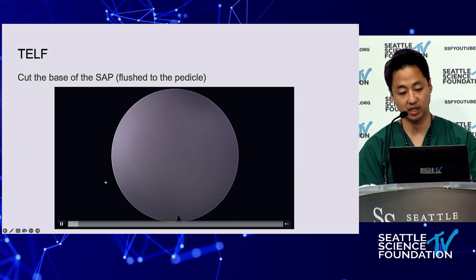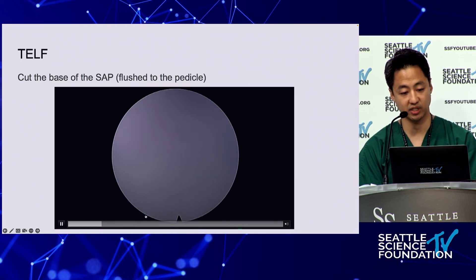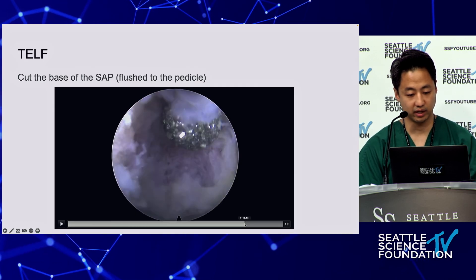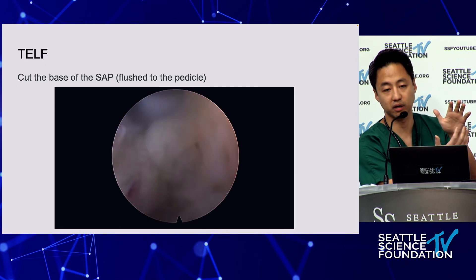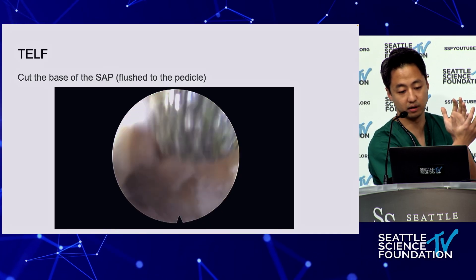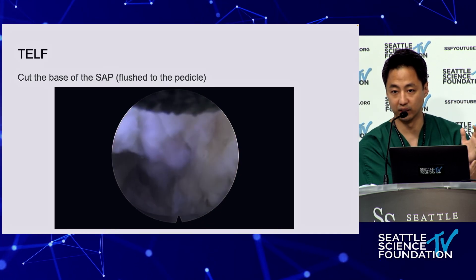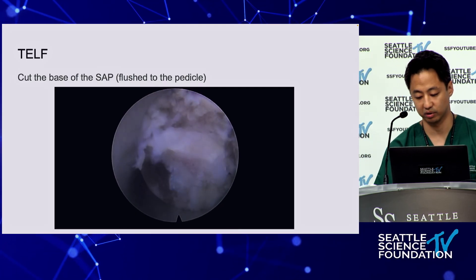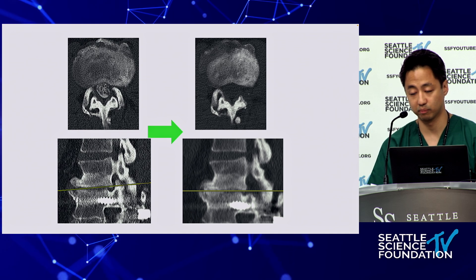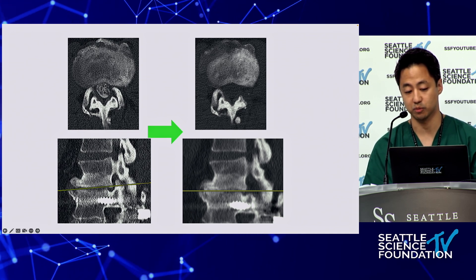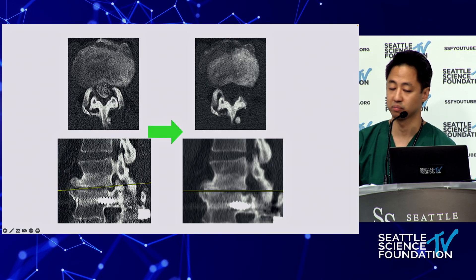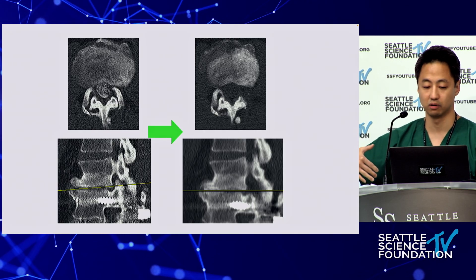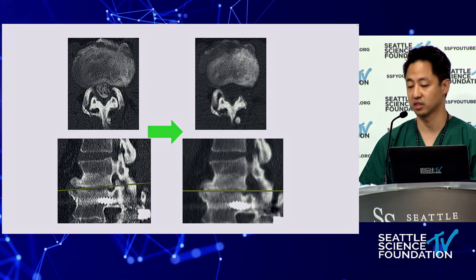On the right side you can see the facet line at 12 o'clock. Once I'm done drilling, the ligamentum flavum is covering me once I get through the cortical bone — so I know I'm close to the pedicle. The tip of the SAP has been completely disconnected. On pre- and post-op images, I drill on top of the pedicle to disconnect that SAP completely, and because the ligamentum flavum is attached to the top of that pedicle, I know I can do this safely with the drill. You can see the expanded foramen.